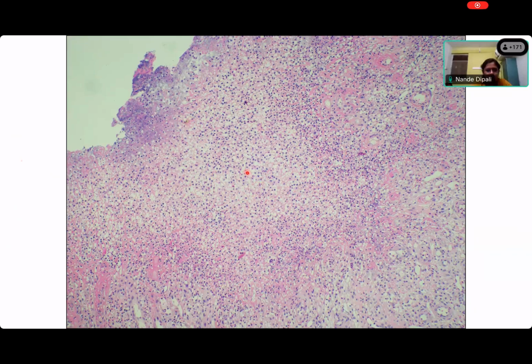Where is it? I can't see. Where have you drawn the base of the ulcer? I can't see it. Can anybody see it? It may be very, very thin. Take the second pen, Deepali. There are 2 pens. Take the second pen, then you will get a color, right? Choose any color that you want, but go down and press the biggest. This is the base of ulcer. Okay, you've drawn something here. Now I know what you're trying to show. You're saying that this is the base of the ulcer. Yes, Deepali? Okay. Continue.